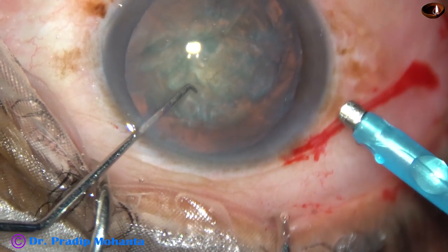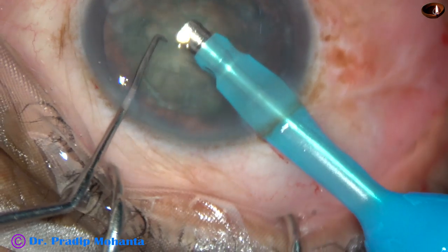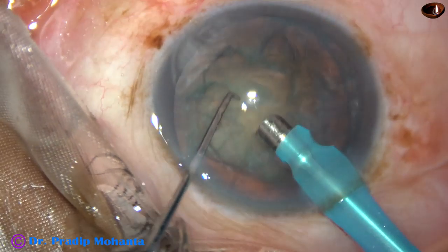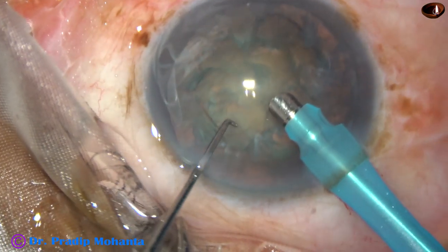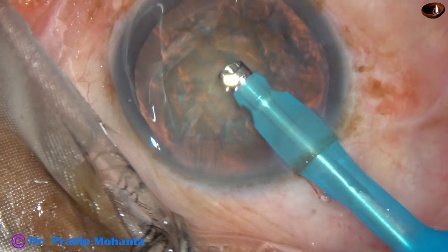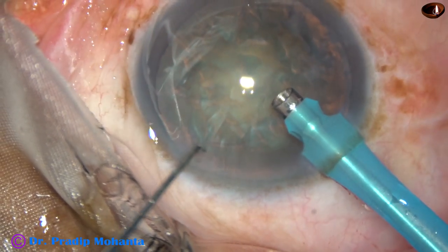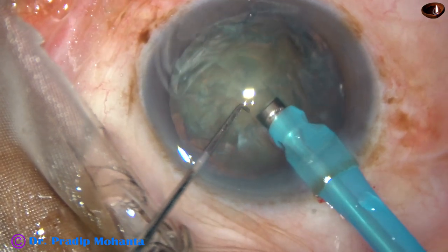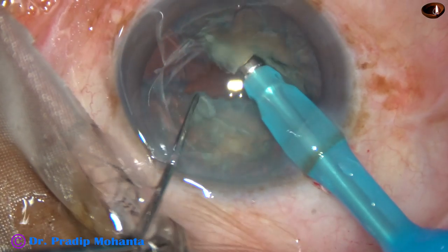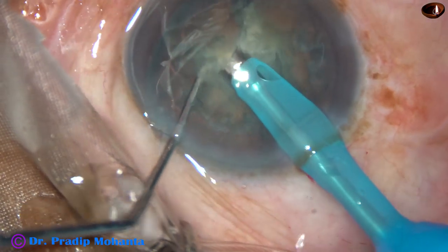Here it goes. Irrigation is on. The tip goes beveled down. Some superficial cortical lens matter is removed. Then the handpiece is turned with the help of the left hand. The nucleus is chopped into several pieces — this is direct chop. The tip is buried into the substance of the nucleus, the nucleus is held very firmly, and the nucleus is chopped.